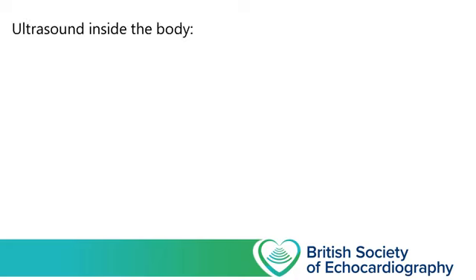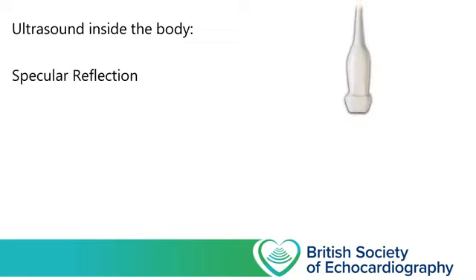Now that we understand how we've generated a wave of kinetic energy, let's consider what happens to that wave once it passes into our patient. So what can happen to that wave? Well, some of the energy will be reflected straight back towards the probe. This is essential because the whole basis of using ultrasound to image the body relies on the fact we can reflect energy off structures within the body and detect it as it returns to us.